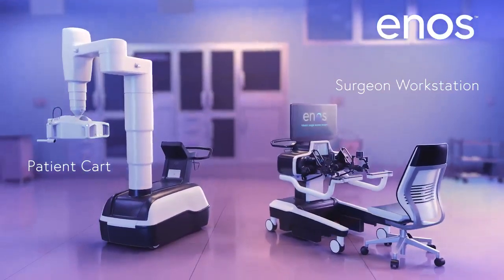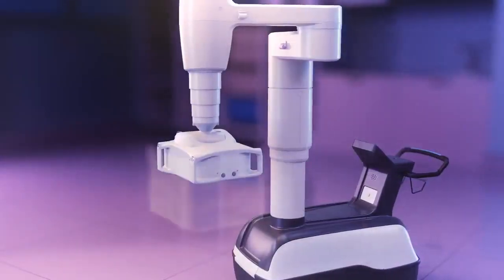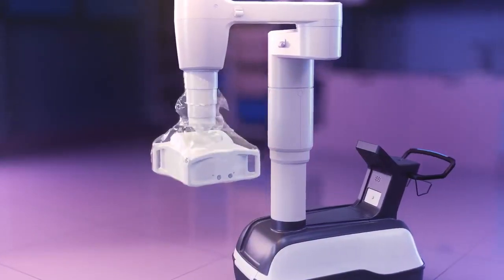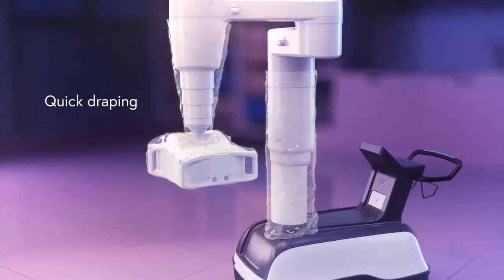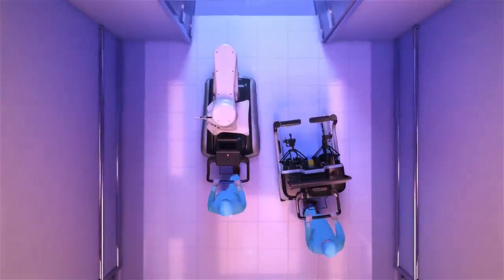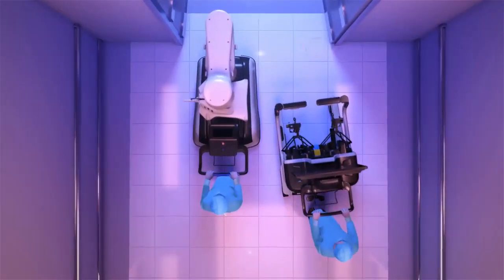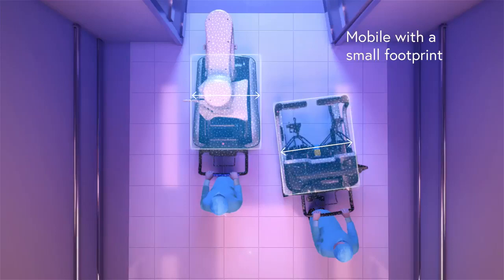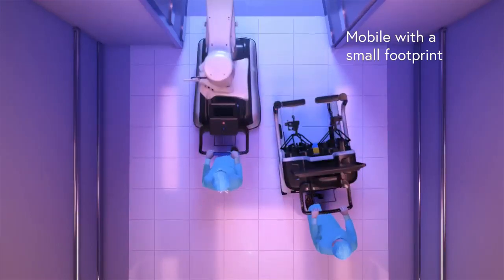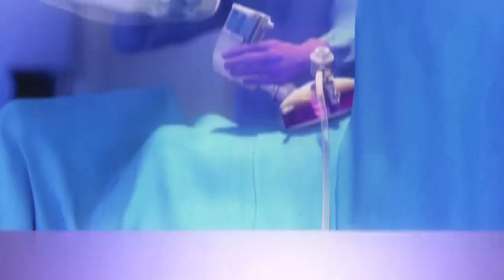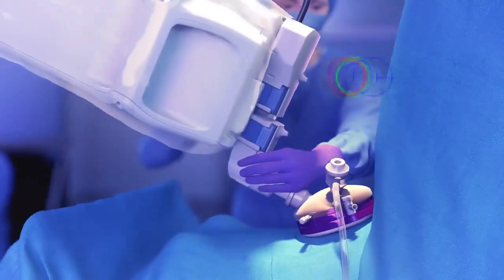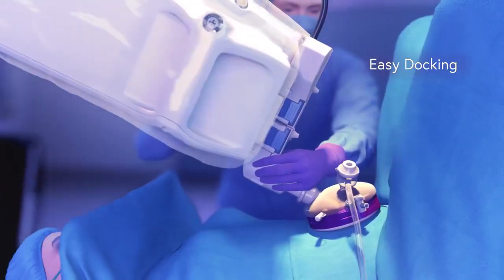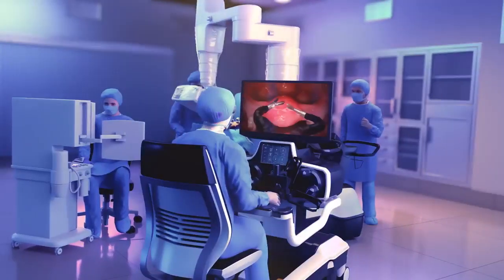The unique construct of the patient cart allows for quick draping. The streamlined patient cart and surgeon workstation are designed to be mobile with a small footprint, which facilitates easy docking.